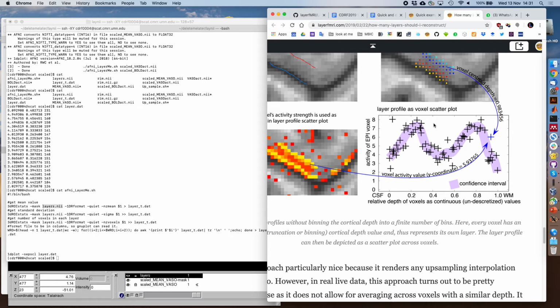So that's why I'm just wondering. Look, all these models are consistent. You start with 3 axioms and you build the math and statistics. They're all consistent if you use them the way they're supposed to be used. So it's not like you can do post hoc whatever you want, right? Right, but in what way are point cloud statistics supposed to be used? That's the difficulty. So now with that question, you're just moving the goalpost, right?